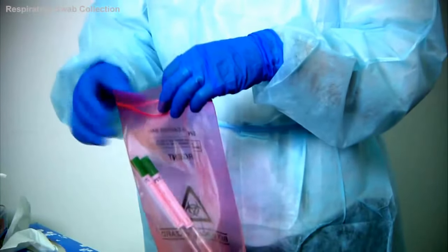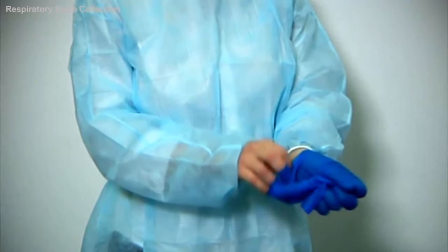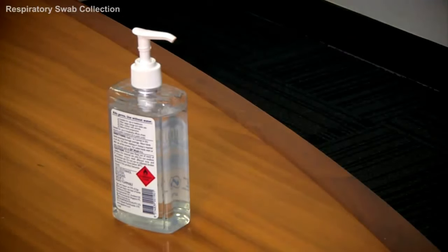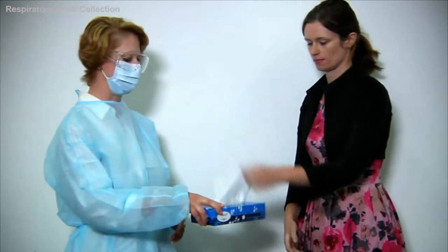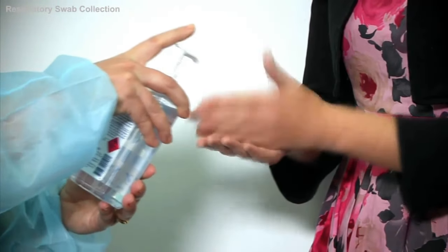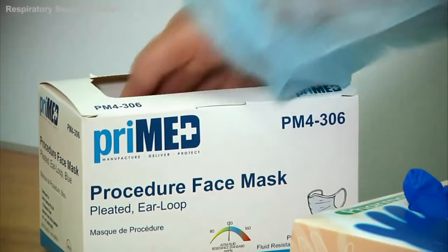The collection procedure is now finished. The collector removes their gloves and performs hand hygiene. Give the patient a couple of tissues, which they can place in the bin after use. The patient is then asked to perform hand hygiene, and you give them a new clean mask.